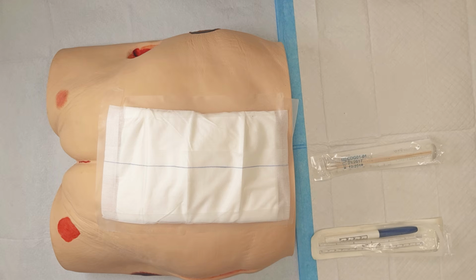So before we get ready to remove the patient's dressing, of course, just like with all your other skills, you want to verify the order, that there is an order for wound dressing change. That order should have any orders as pertaining to if that wound will need cleaning, what supplies you will need for cleaning and dressing the wound.